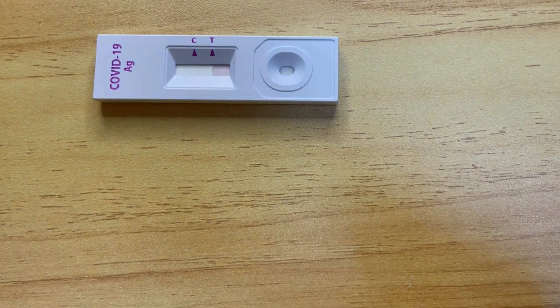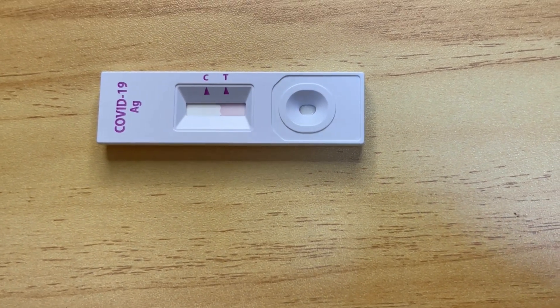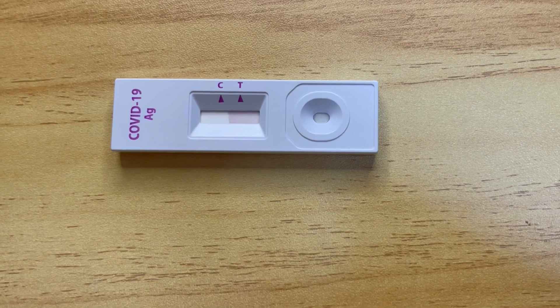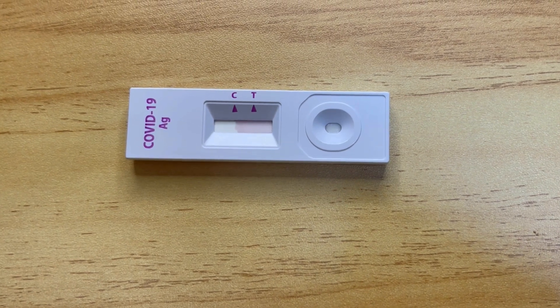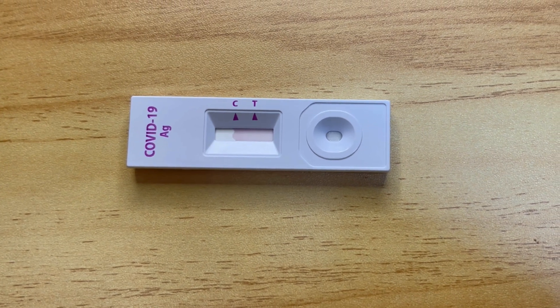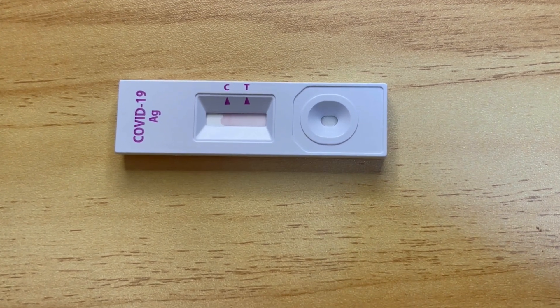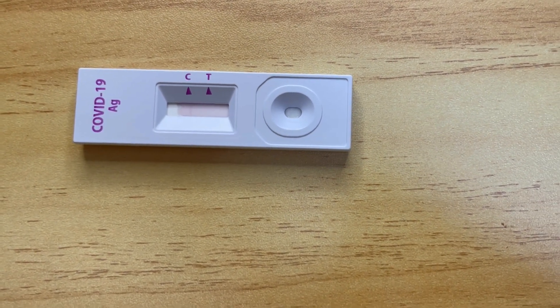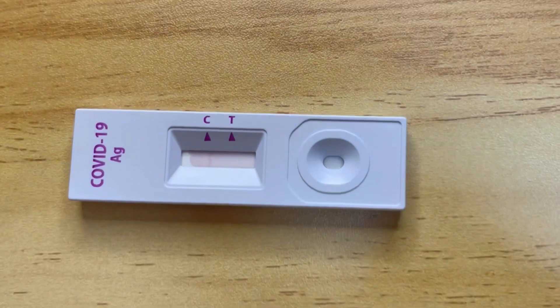So, just like a pregnancy test — if there's one line on the C, it's negative. If there are two lines, you are positive. You can see a line appearing on the C, so there's a possibility of being negative. We have to wait 15 minutes for this to finish.